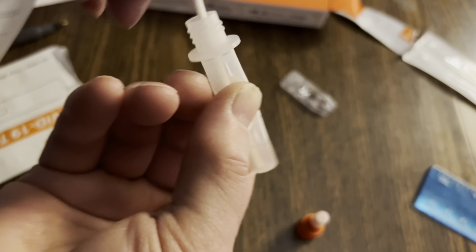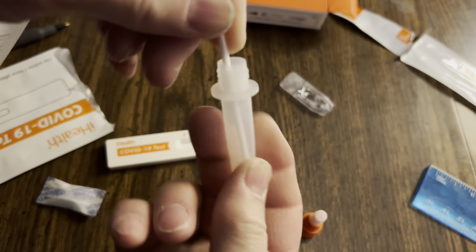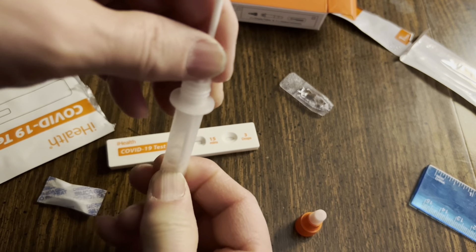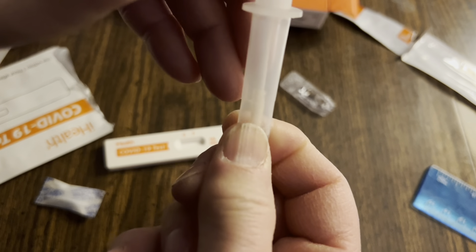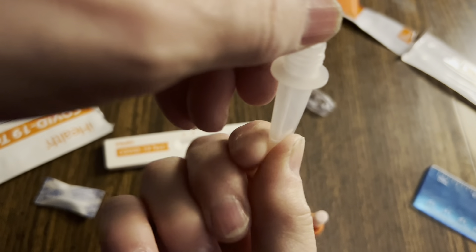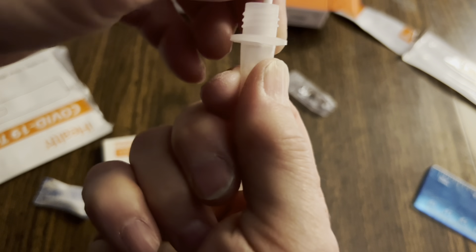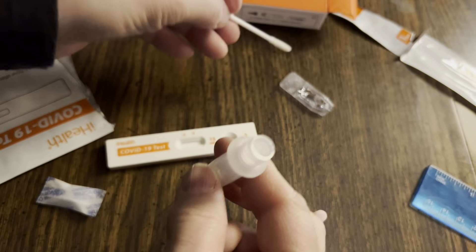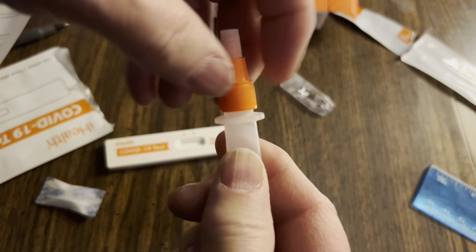Stir this 15 times — 1, 2, 3, 4, 5, 6, 7, 8, 9, 10, 11, 12, 13, 14, 15 — and a couple more for good measure. Then as you pull it out, you squeeze — go up and squeeze. You're squeezing all that DNA, all the COVID juice out of there.